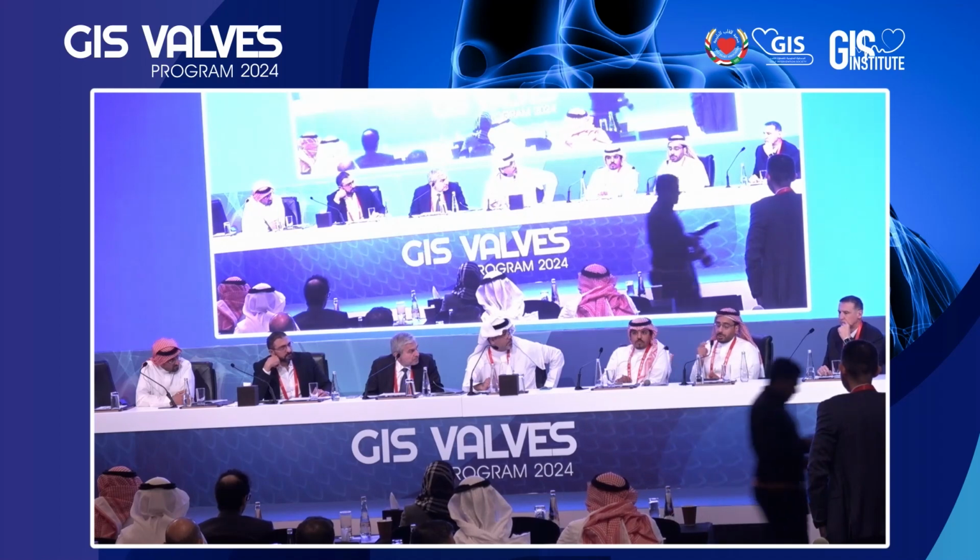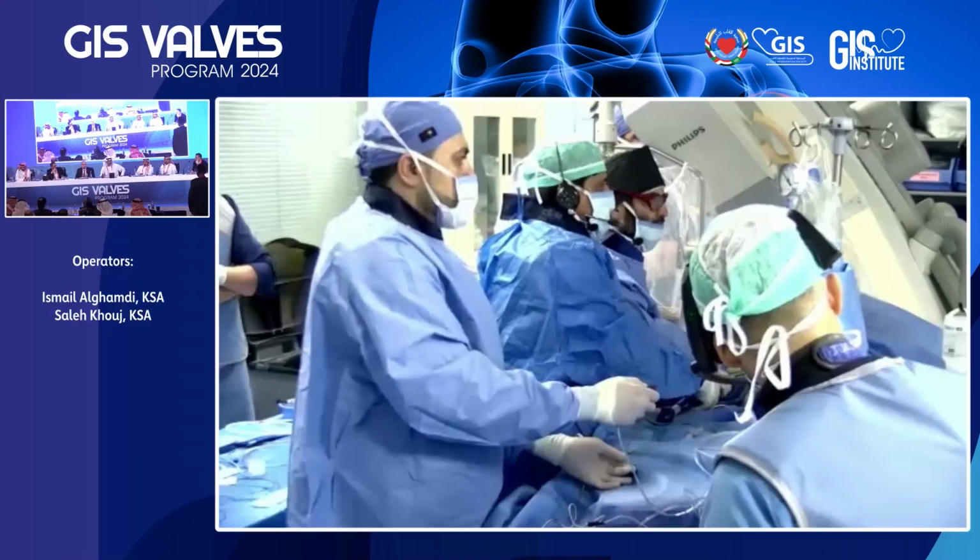Thank you for the question. It's very important, as was previously stressed, to make sure that you are doing proper measurements. Before even checking the measurements, you should make sure that the patient is not extremely hypertensive, which can artificially reduce your mean gradient. Finally, you want to make sure that you have proper LVOT measurement, proper V1 and V2 measurements and traces. And if you truly have a low flow state, meaning a stroke volume index of less than 35, you probably have a low flow, low gradient AS.